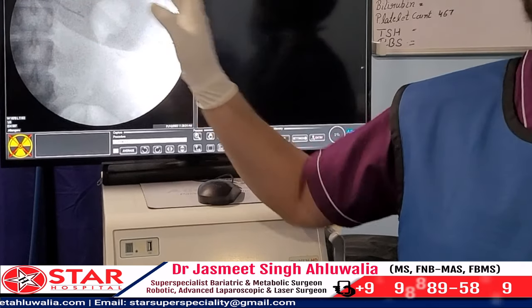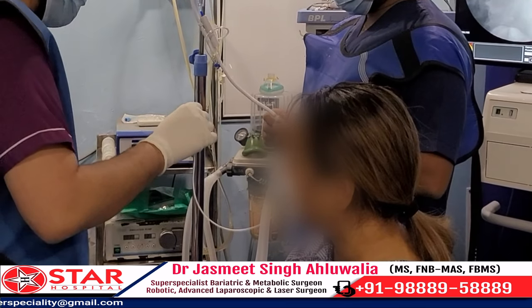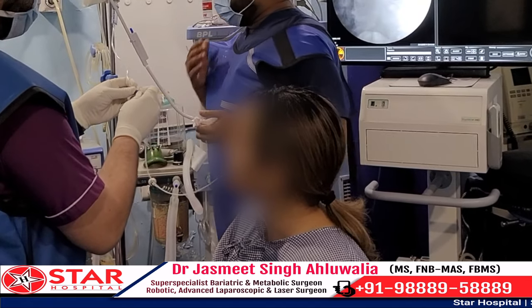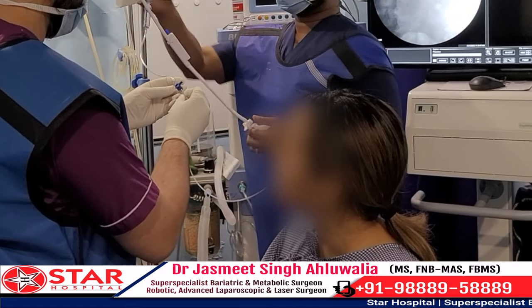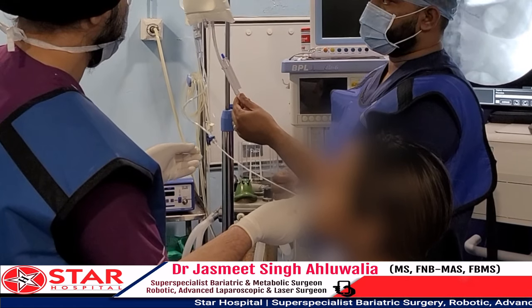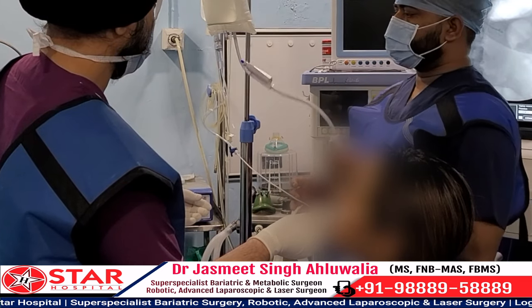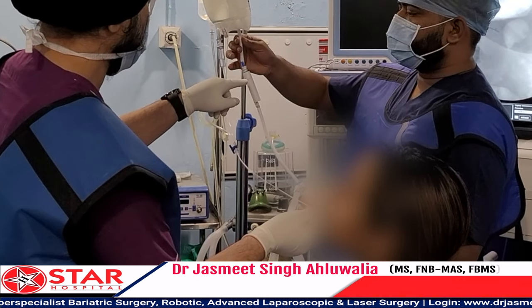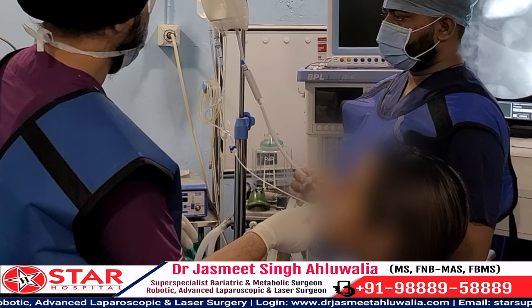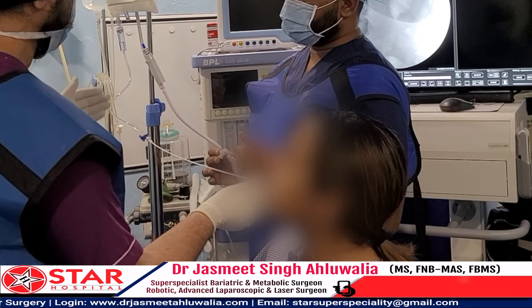We can see the catheter reaching inside the balloon, taking a curve. Once we are very sure that the balloon is inside, we connect the catheter to the bag which contains the filler fluid, which is going to install around 550 ml of fluid into the balloon. Once connected, we increase the pressure inside the bag so that it forces the fluid to go inside. The balloon is surrounded with a capsule, so it takes a little time for the capsule to dissolve before the balloon starts filling.